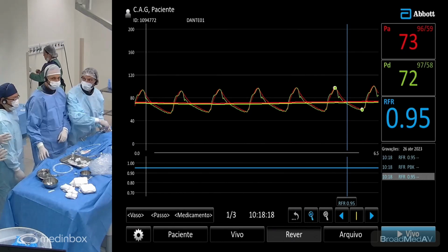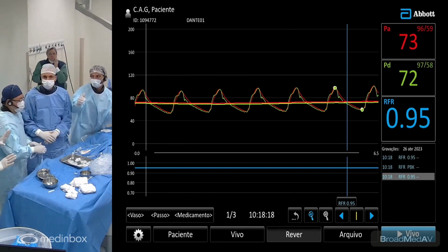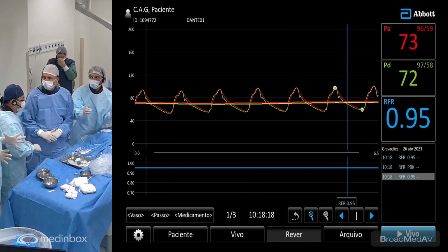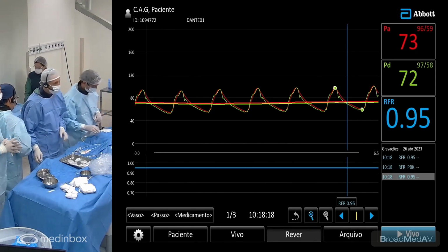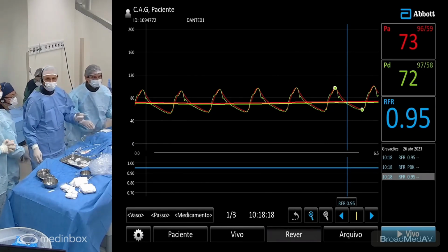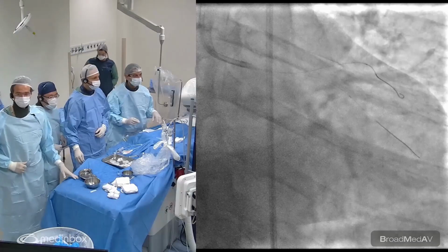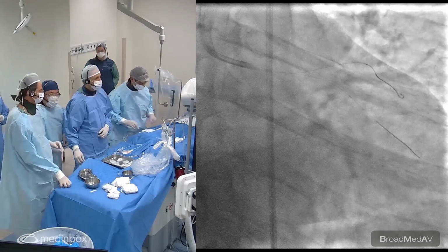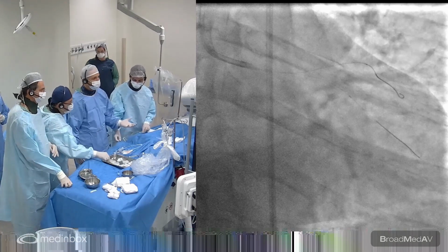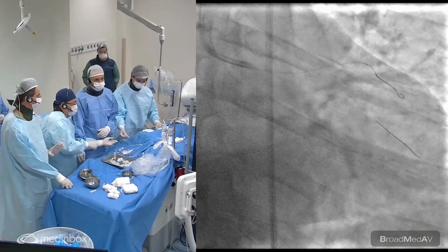Okay. So there is no severe disease in the branch and either in the left main. There is some disease in the left main, but not severe. A provisional stent. Okay. How about the circ? Can you have the angio back? Okay, great. Thanks. We thought that for the circ, there is no significant disease, and the angulation makes it less likely to be compromised. So we decided to only protect the ramus.